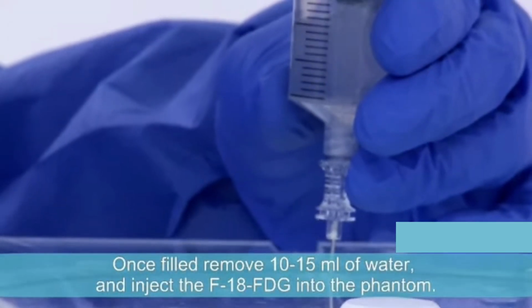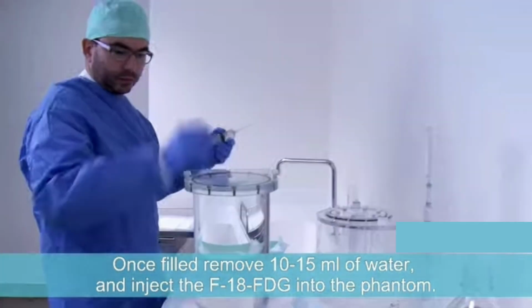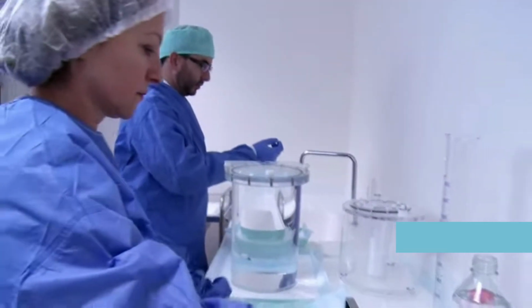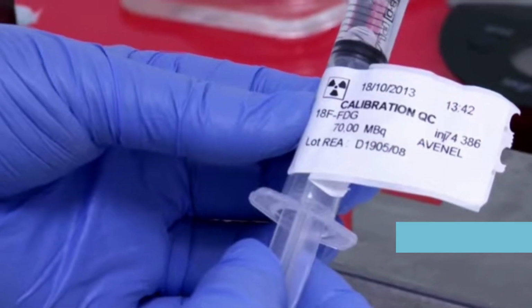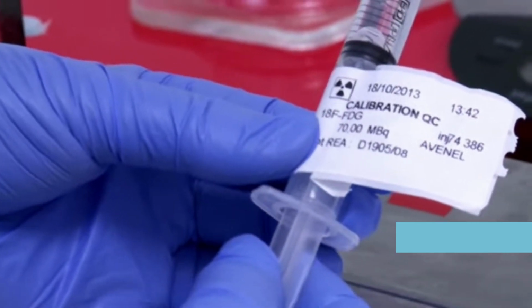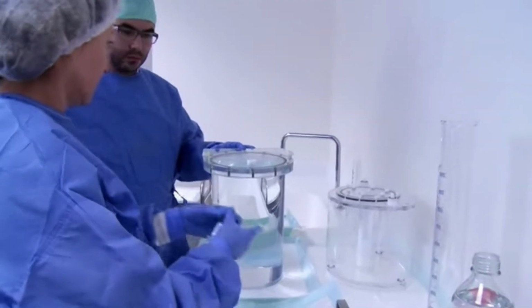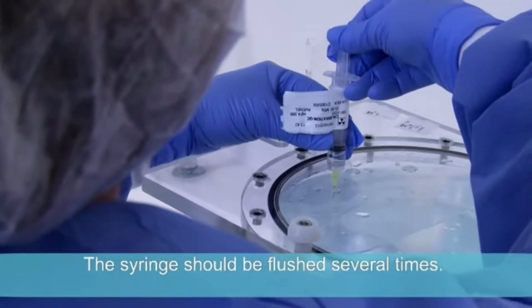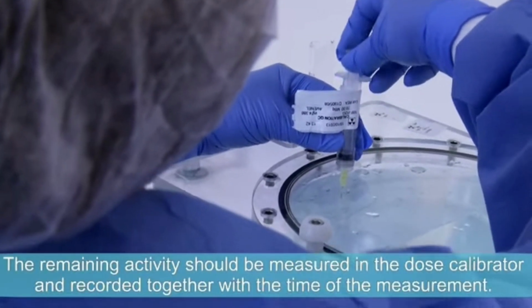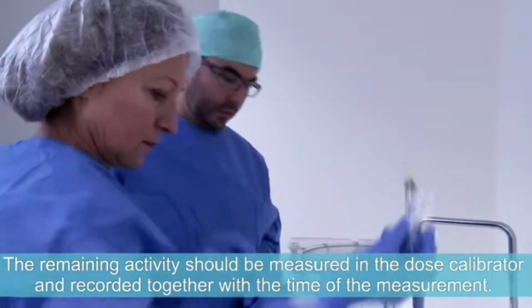Once filled, remove 10 to 15 milliliters of water and inject the F18 FDG into the phantom. The syringe should be flushed several times. The remaining activity should be measured in the dose calibrator and recorded together with the time of measurement.